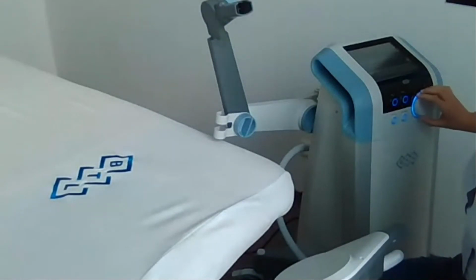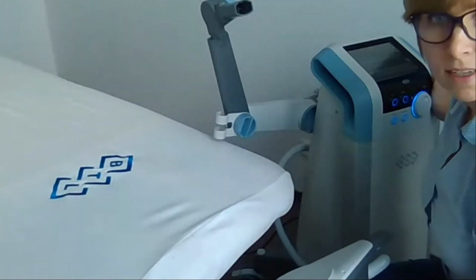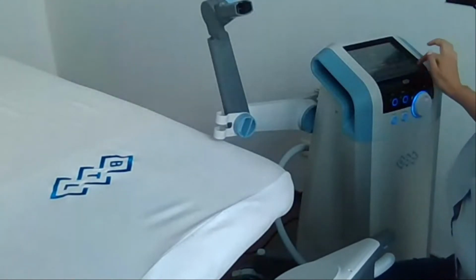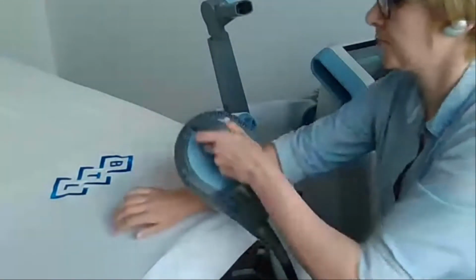I would like to show you as well what is the difference about myostimulation regarding the muscle relaxation. So you can hear exactly how the first frequencies look like.